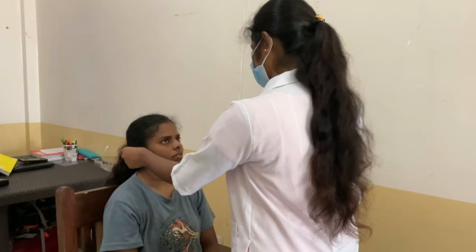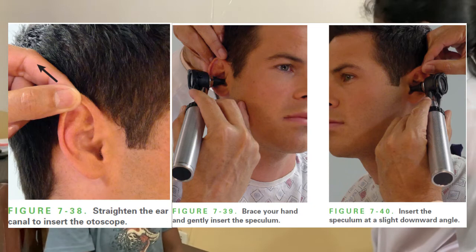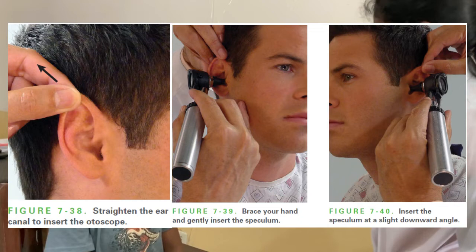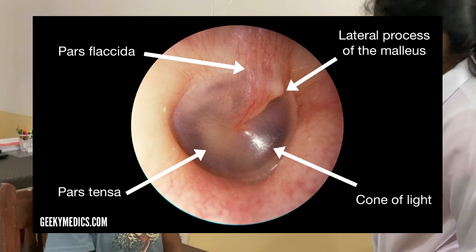Finally, otoscopic examination. Using an otoscope, we can observe the internal structures of the ear. Some basic tips: hold the scope near the head, pull back on the ear you are examining with the hand not holding the otoscope in order to straighten the ear canal, and brace your pinky against the patient's skull to avoid rapid movements that will cause the scope to go too deep into the canal. We are generally looking to see a non-diseased ear canal and intact tympanic membrane.